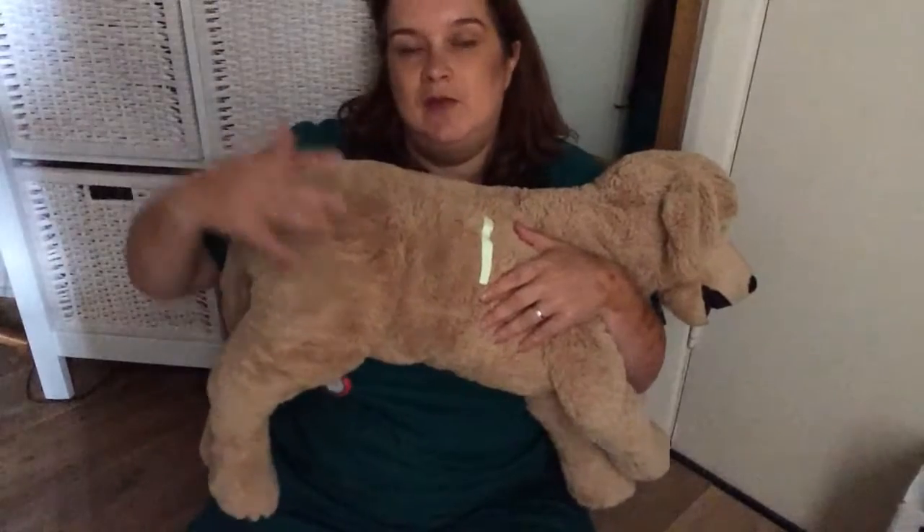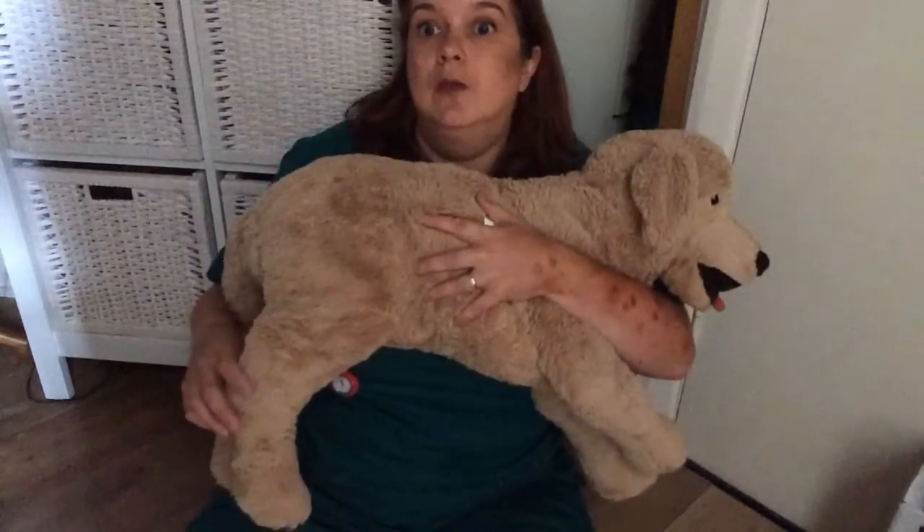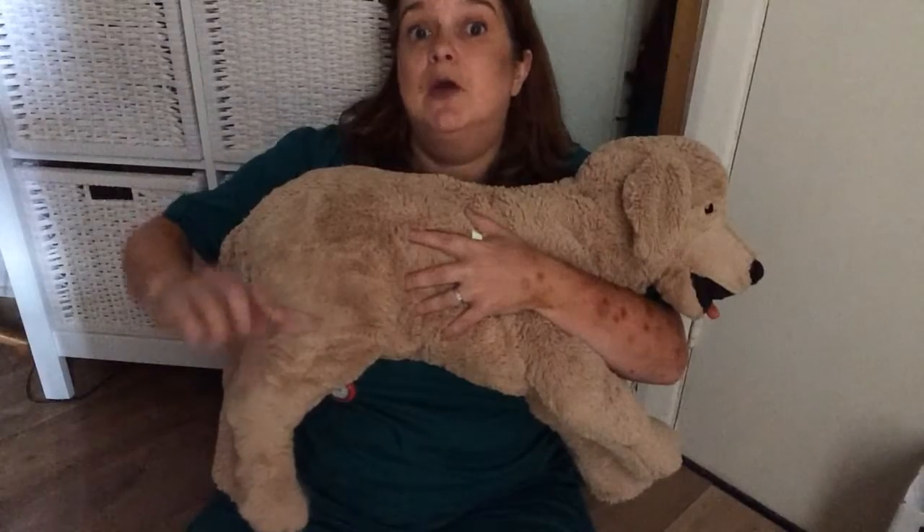So what you're going to want to think is: look at the whole dog. You could actually even start where we started with the thorax, divide it into two, move back, then consider — if I'm going to find the hock, I need to find hip, stifle, hock. Then I'm wanting to take the tibia-fibula, doing between the stifle and the hock including the joints cranial and caudal to that aspect. You can include the toes, but if the legs are so long you might not — and that's acceptable because you would have included joints cranial and caudal.